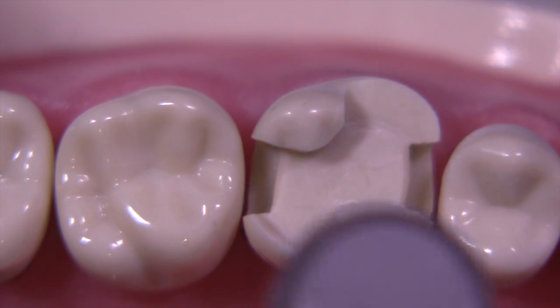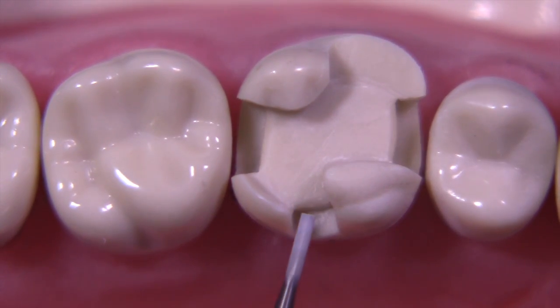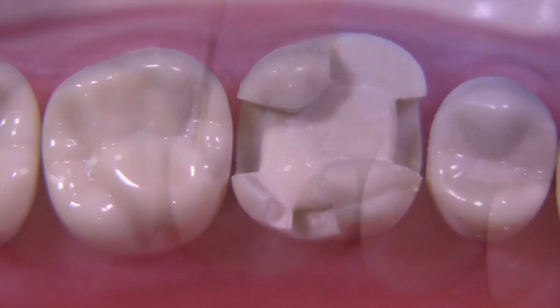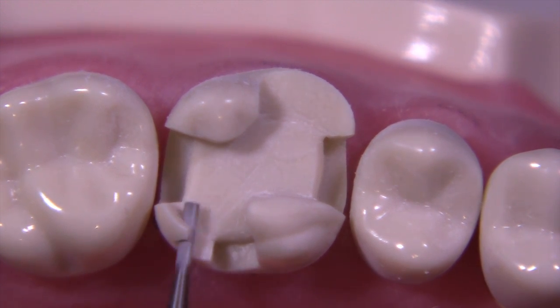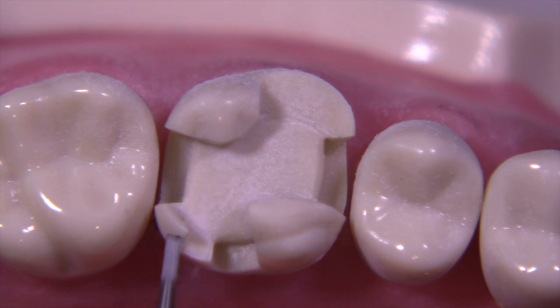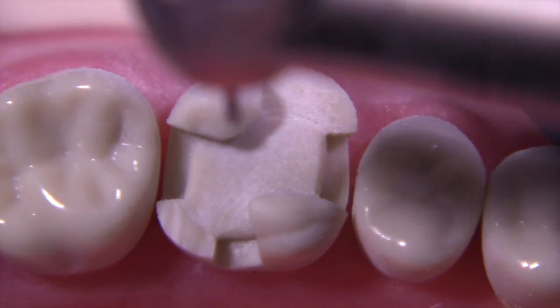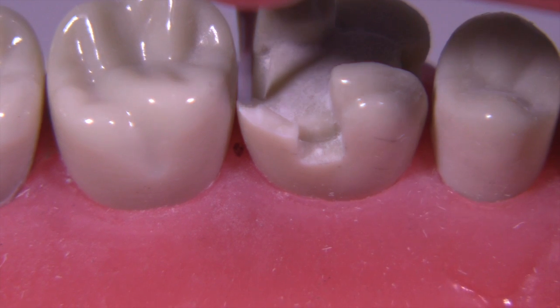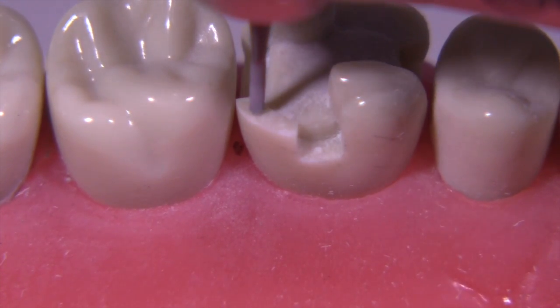Now we turn our attention to the distal lingual cusp. This will be a little easier to remove but also trickier because the extension on the preparation is quite minimal on the distal lingual - if we had extended it a little further lingually, it would have been a much easier cusp to remove. You can check midway through and see it's about 1.5 millimeters now, looking good. Continue removing the cusp carefully to avoid hitting the adjacent tooth. You may want to use an interguard to protect the adjacent tooth in these situations - I went ahead without interproximal protection, holding the bur vertically to remove tooth structure if concerned about hitting the adjacent tooth.